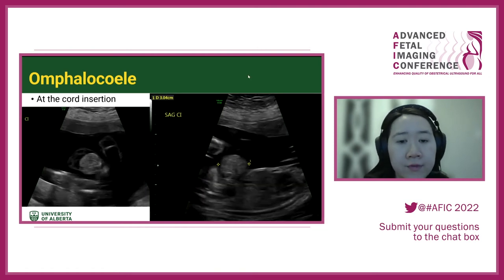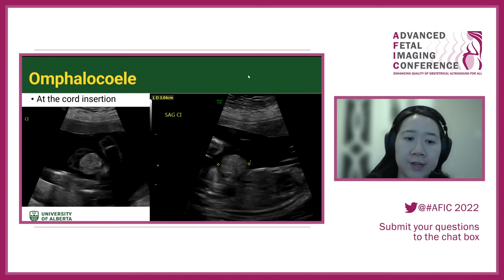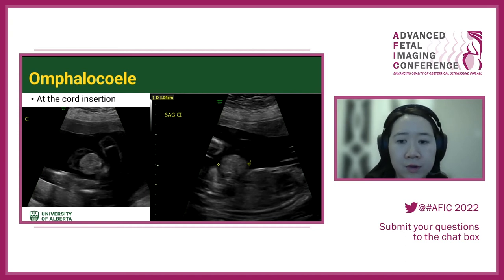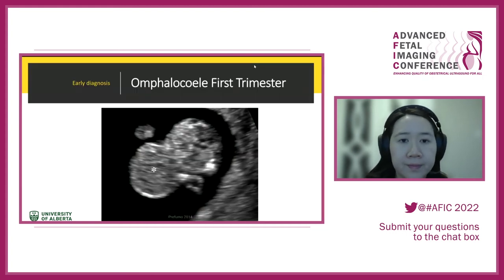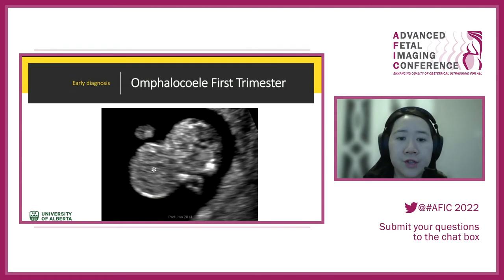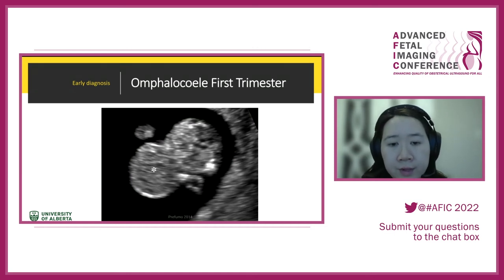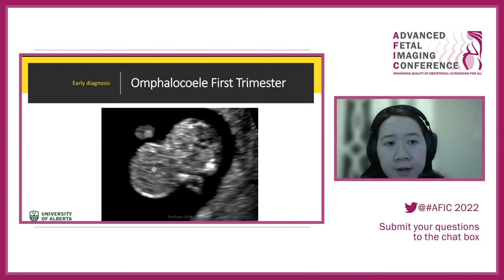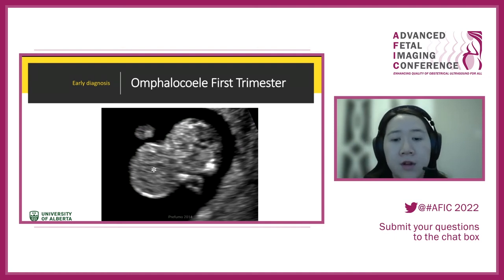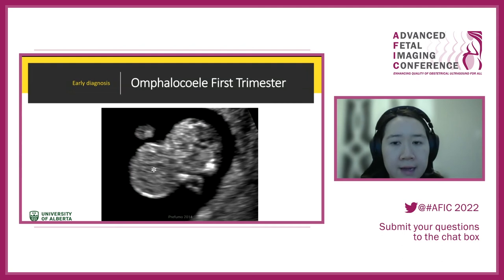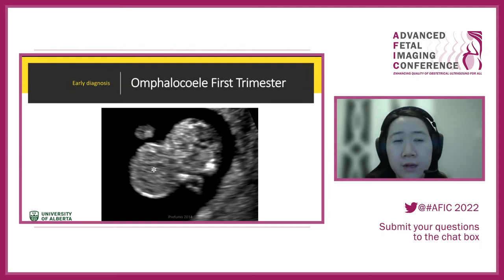You can look at omphalocele in several ways: sagittal view of the cord insertion and transverse to identify exactly what is coming out. In the first trimester, you can see a uniform protrusion — ideally with color to identify where the cord insertion is going. Diagnosis after 12 weeks is ideal to rule out physiologic gut herniation; it can also be difficult to see in the first trimester depending on maternal body habitus.